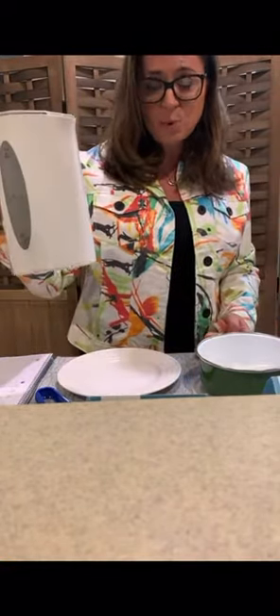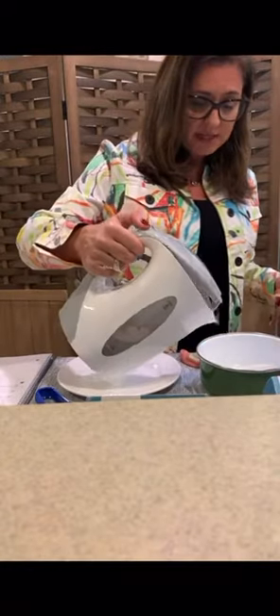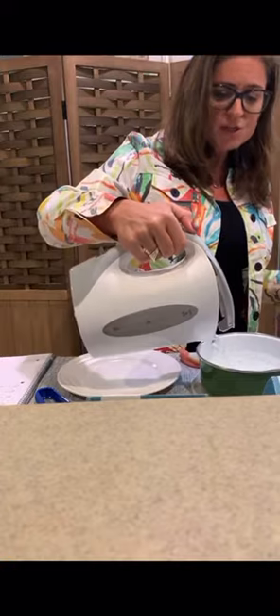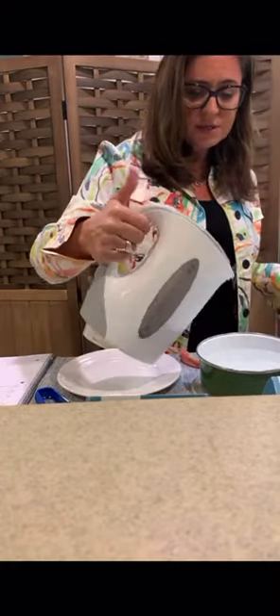As you can hear, the water is currently boiling. This is just your standard electric tea kettle. I put water in there, turned it on, and now it's boiled. I'm going to pour it into the cup or the bowl. You just want enough water so that you can cover the Easy Denture.